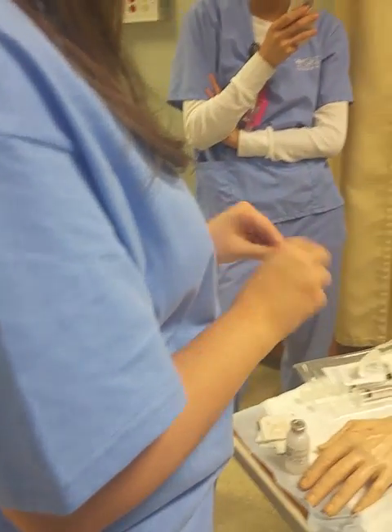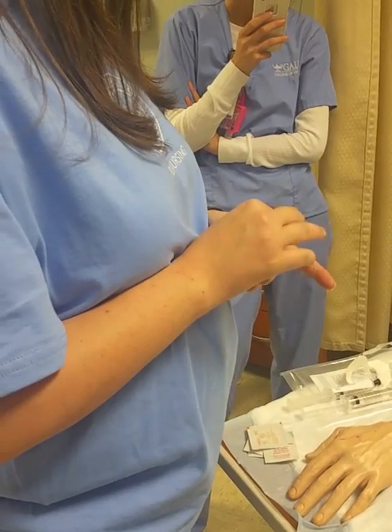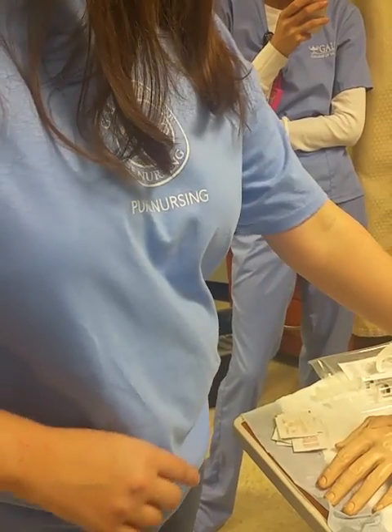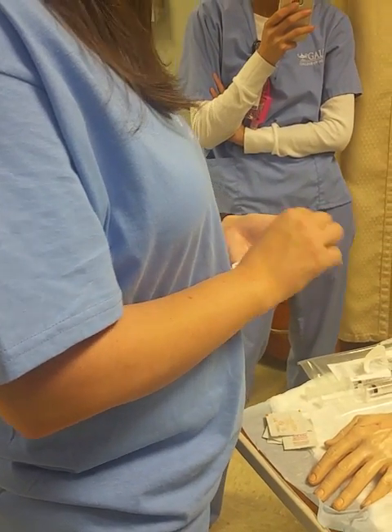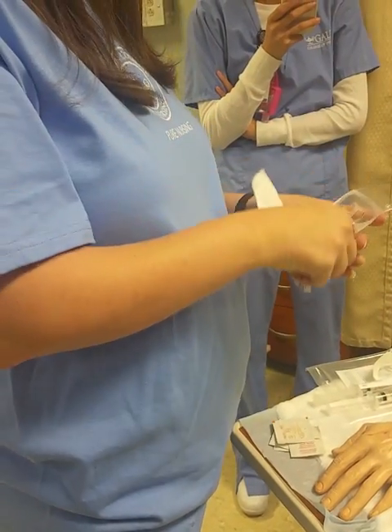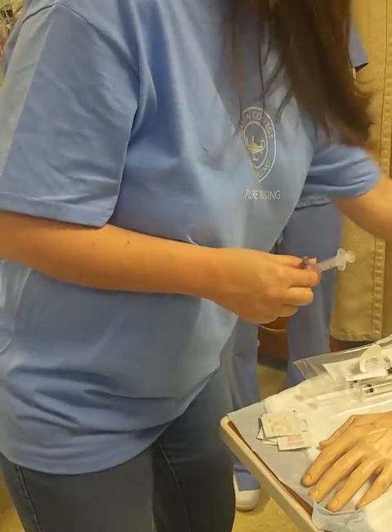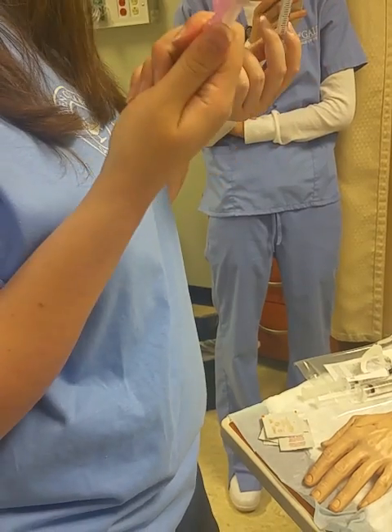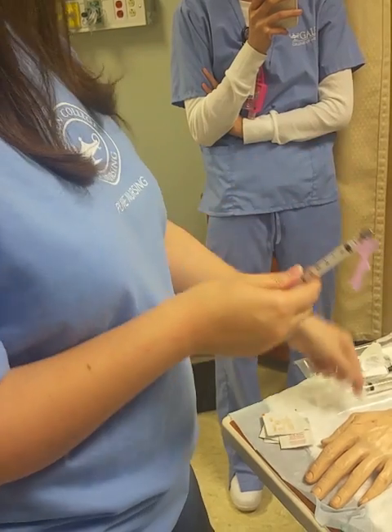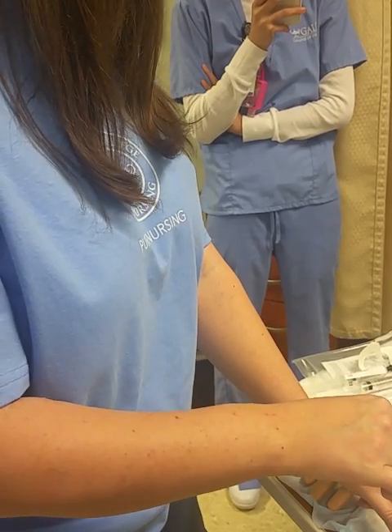So I'm going to clean the top of my vial. Let it dry. Now, sometimes you'll have a needleless connector where you just push it in and then you twist your needle onto the top of it. Most facilities have gone needleless. We have not. So we're going to have syringe and needle. I'm just going to draw up the air with this big old needle. 2 mLs of air.